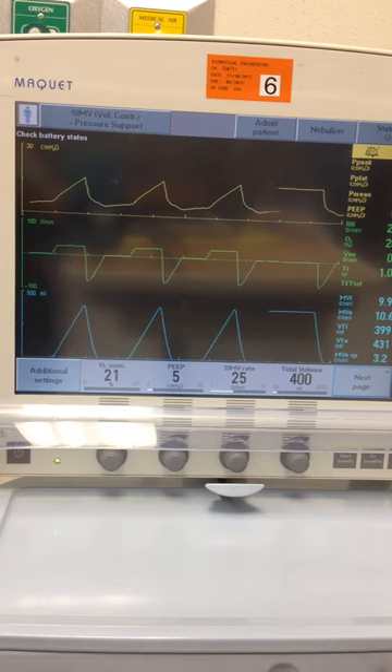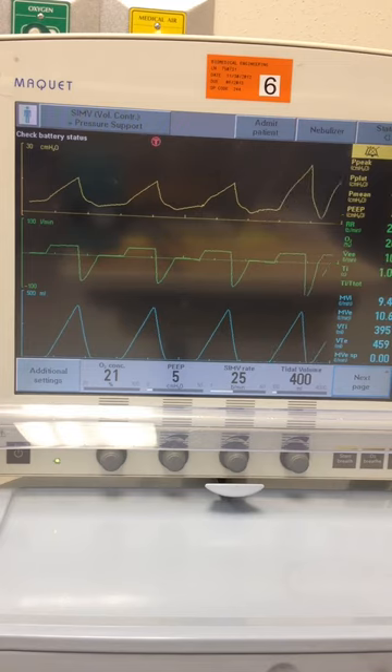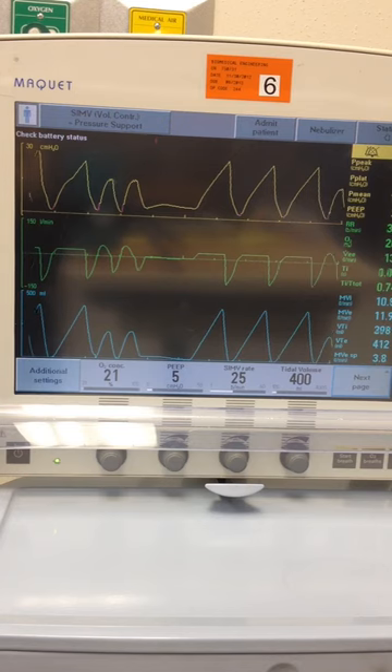Let's go ahead and change our compliance and see what that change does. We're going to go from 40 to 20, so we're decreasing our compliance pretty significantly. What would we expect? We would expect a change in our pressures — a change in compliance equals changes in pressures when you're in a volume-controlled mode.